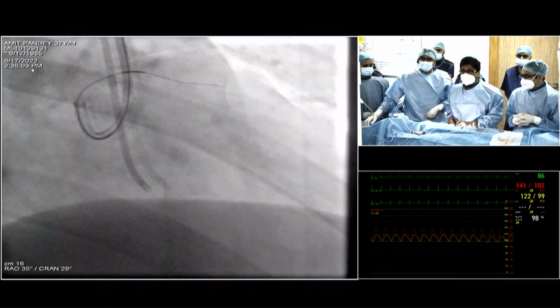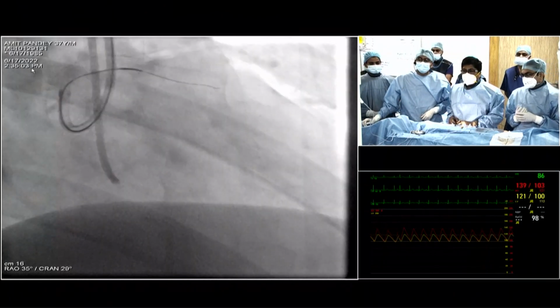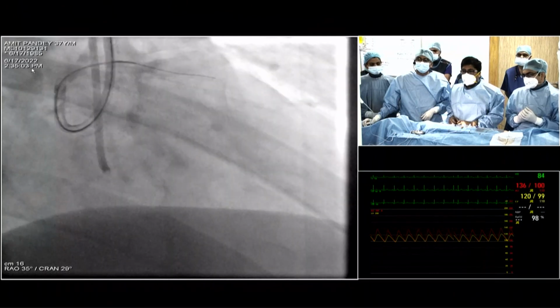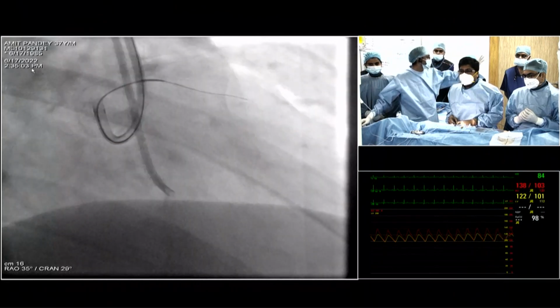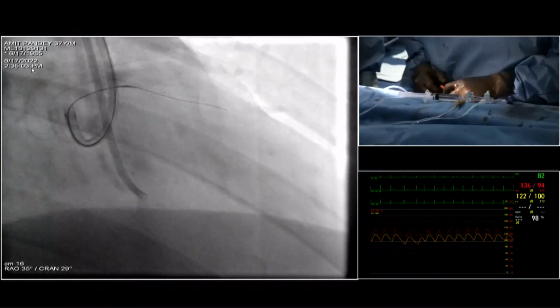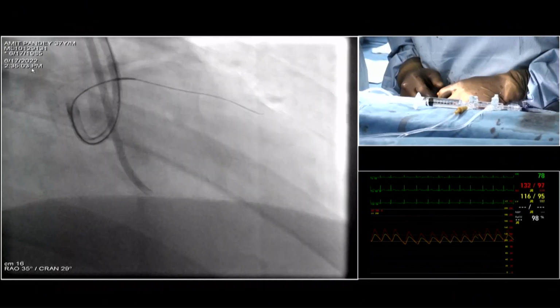Okay. Do you want to tell the audience what you are doing with your fingers? Tell them how you are manipulating this wire. Can someone focus it, please? Thanks. So it's kind of a controlled drilling that you're doing?